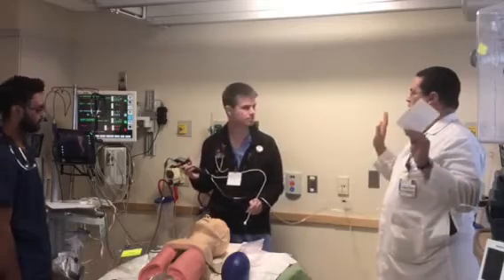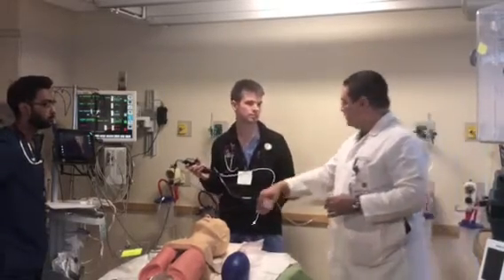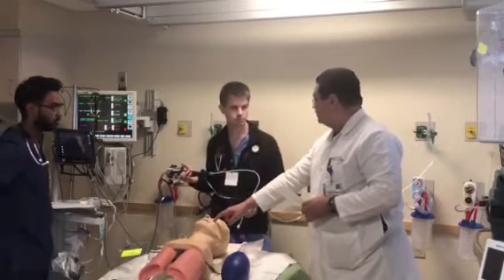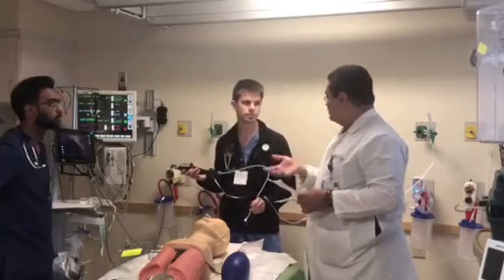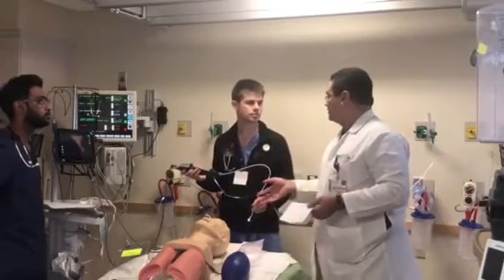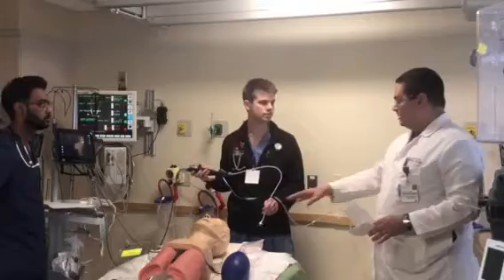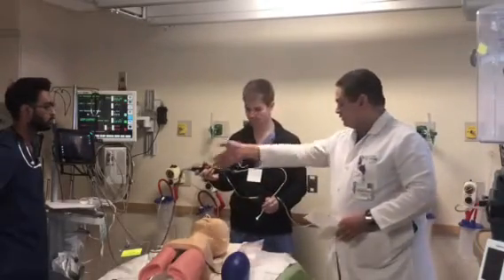Okay. You can't do an awake fiber optic in this situation. He's gonna vomit. Even if he stops vomiting now, when you put the tube, the scope inside, he's gonna feel it. When you do the scope, they feel it somehow. Even if you numbed it 100%, he's still gonna feel it. So he's gonna vomit. So you're inviting vomit. You can't do that. Okay. If you're lucky enough that the saturation is still 90% and he's vomiting, use it. So throw this away. All right.